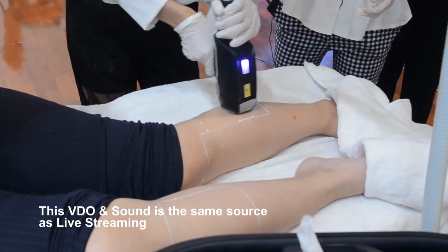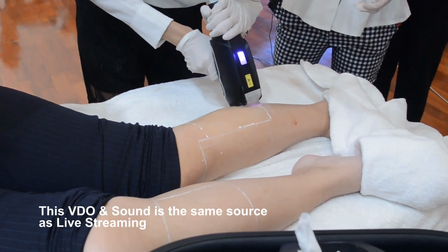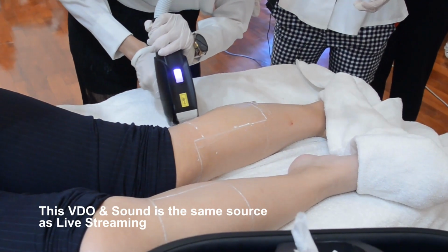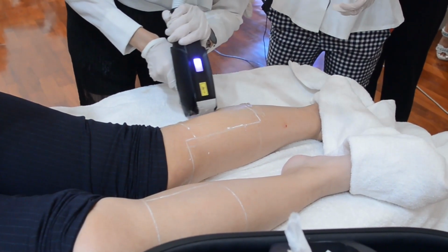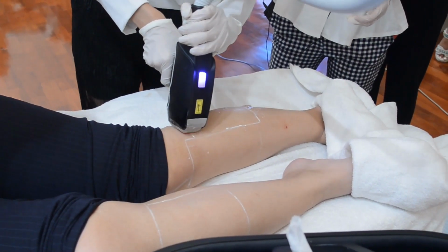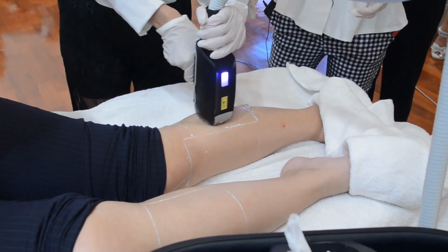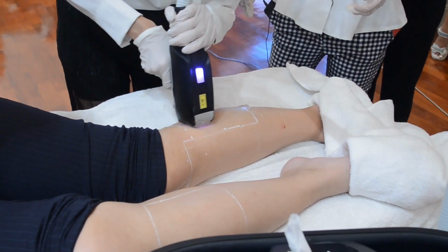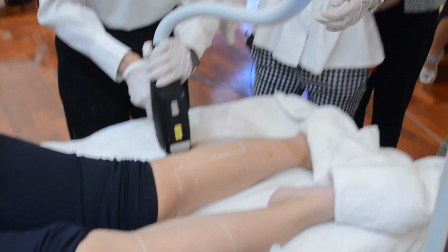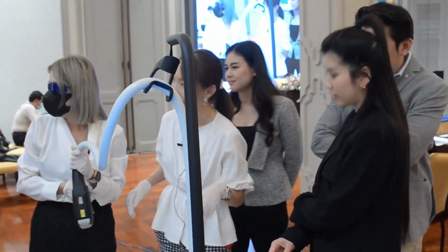Do not tilt the handpiece. It must be fully in contact, do not lift the head. And then move up. Okay. Continue until you hear the alert from the device that the treatment area is completed. Yeah. So this is completed. Okay.